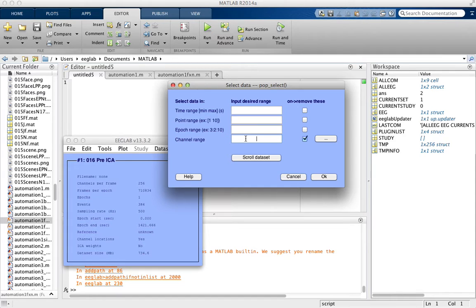So we're going to enter in the list of channels that we want to remove with spaces in between.